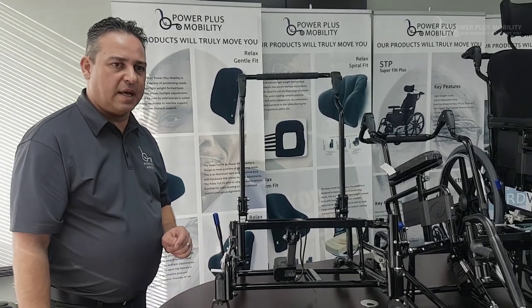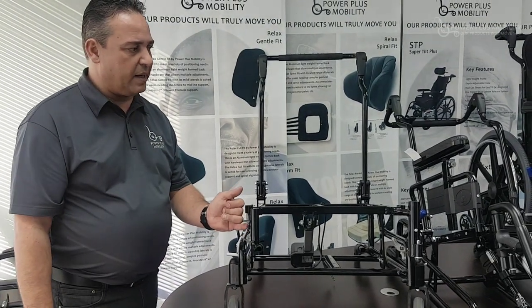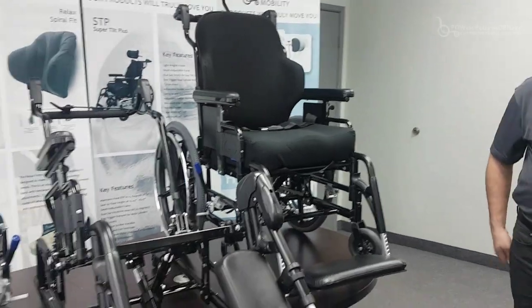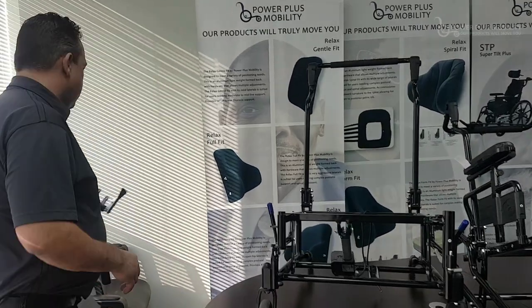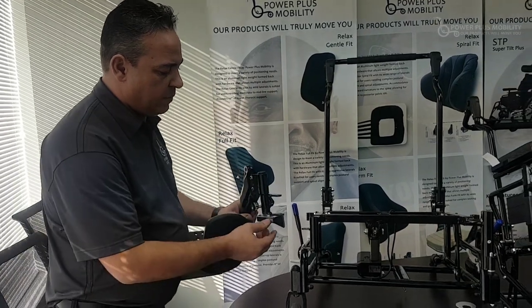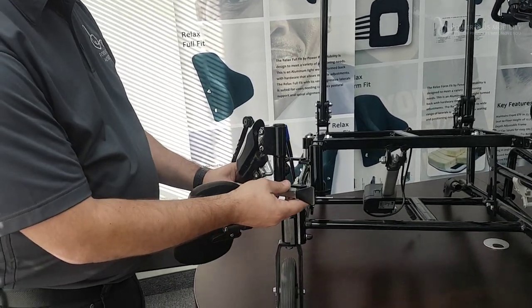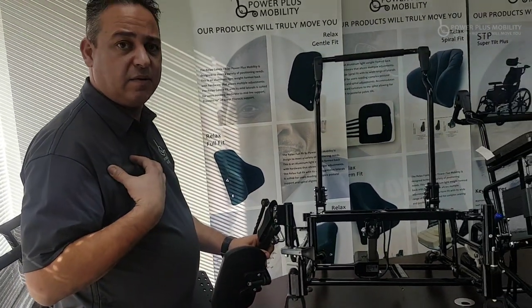The downfall to a pin and saddle is the level of difficulty in mounting — lining your front rigging up with the two pins and mounting it on here. This is what we call a pin and saddle attachment. These two pins would line up with these two pins and then we would latch it shut. It's very difficult to find those two pins as an end user or even as a technician to mount.